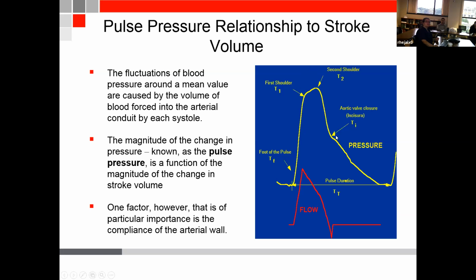You have a systole, dicrotic notch, diastole. And if you were to make some analysis of this waveform, you'll have an idea of what your stroke volume is, and that's one of the major areas of research for the past 20 years, to look into pulse contour analysis to determine stroke volumes and cardiac outputs.